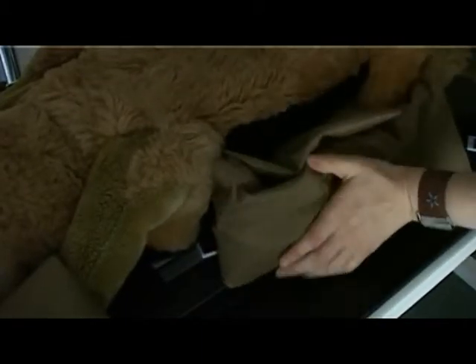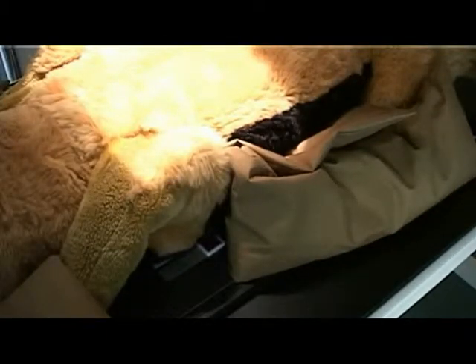You have now correctly positioned the patient for a ventrodorsal thorax, including all the necessary equipment.